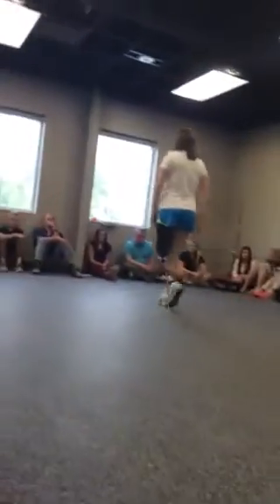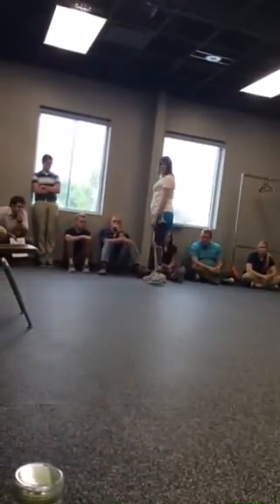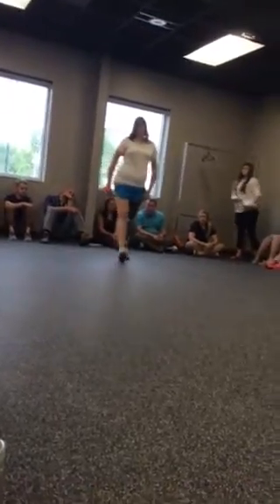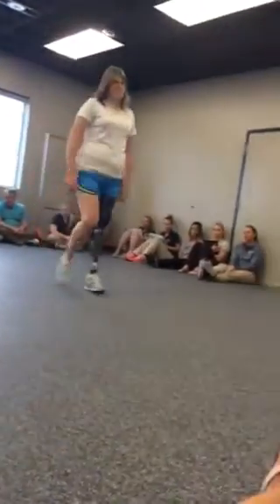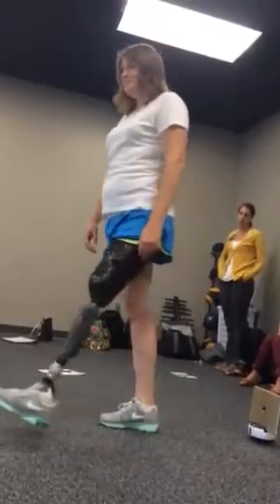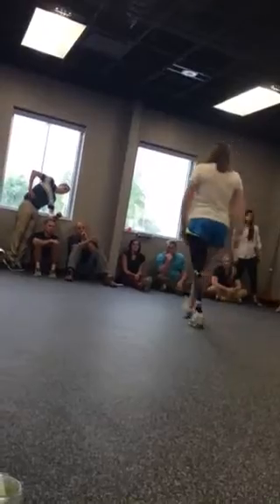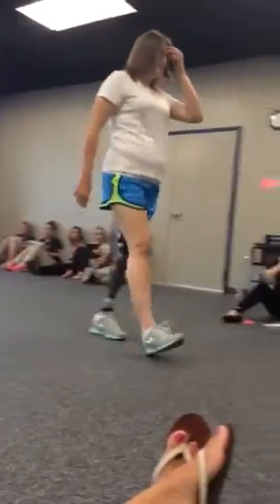Looking at the street. So you guys pull around over here. And it is completely different. If you're doing visual, any kind of observational gait analysis, you want to be perpendicular to the plane that you're watching all the time, or you're going to see different things. For sure. So is it a little adducted, the prosthetic side? Okay. Yeah, one more time. I told you I'd say that a lot. Okay. Good deal.